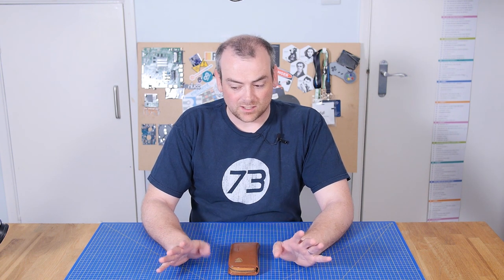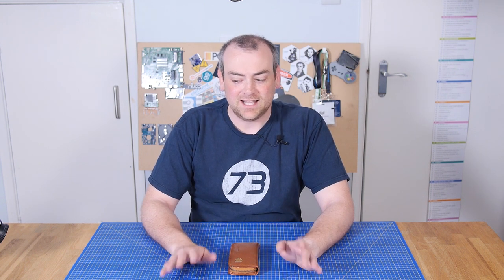Welcome back to The Electronics Inside, the show where we tear down tools and appliances just to find out what's inside. I'm David and I kind of hope you'll support me on this one — I'd like a little bit more of a serious episode for a change. This week we're going to talk about something that is particularly important to a lot of people in the world, and that's hearing aids.